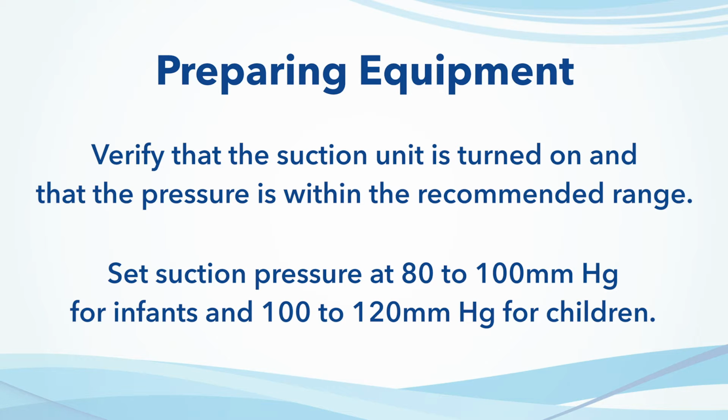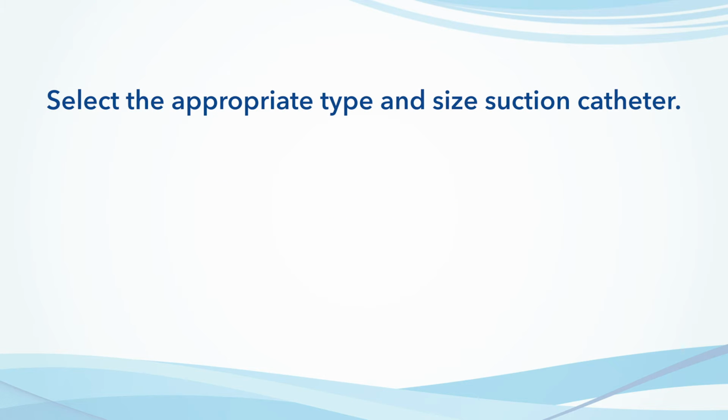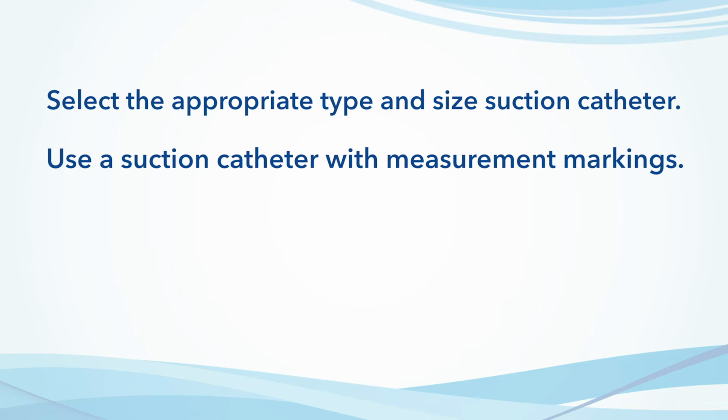Set the suction pressure between 80 and 100 millimeters of mercury for infants and between 100 to 120 millimeters of mercury for children. Check the unit's negative pressure by occluding the end of the suction tubing before attaching the suction catheter. Select the appropriate type and size of suction catheter. Use a suction catheter with measurement markings.